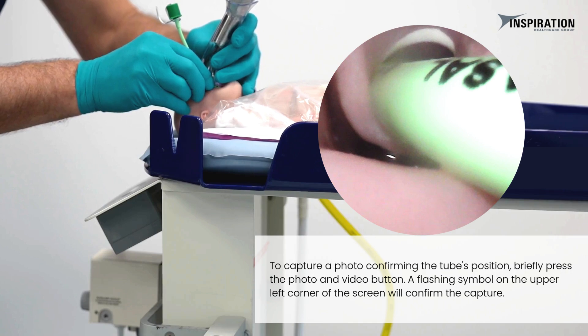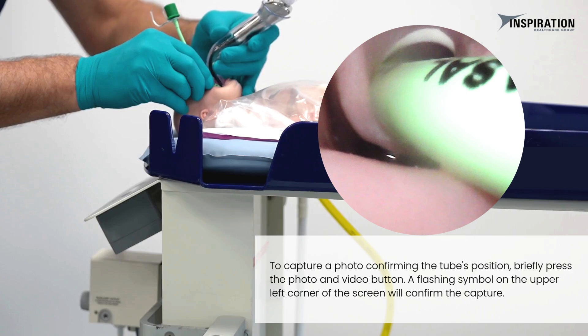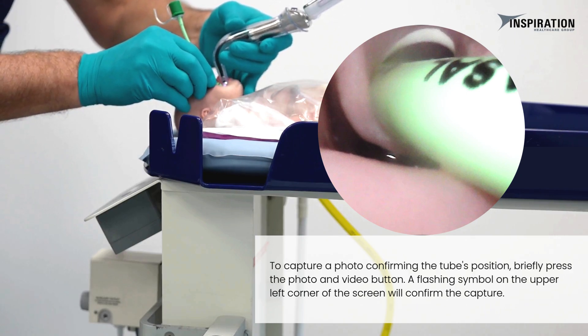To capture a photo confirming the tube's position, briefly press the photo and video button. A flashing symbol on the upper left corner of the screen will confirm the capture.